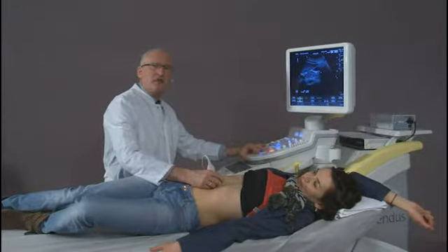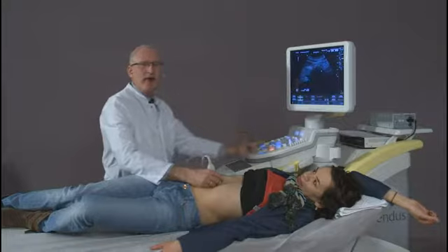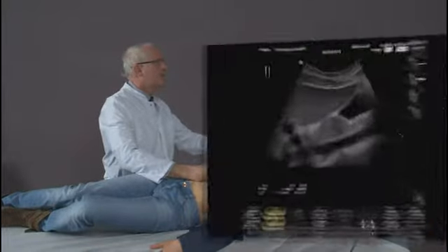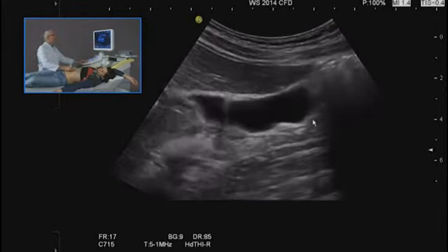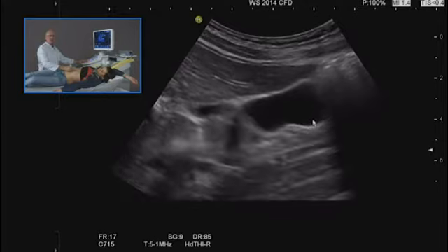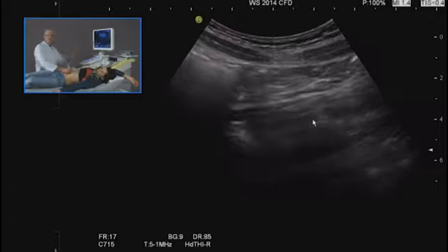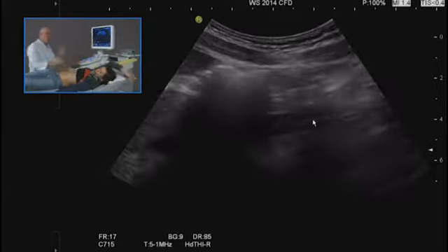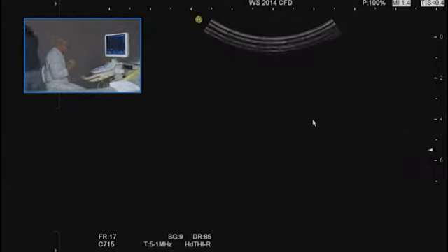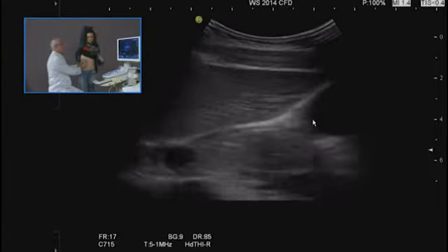The evaluation of the gallbladder should be done after a fasting period of, let's say, 6 to 8 hours. Take a breath. Even after this fasting period, sometimes, breathe normal, hidden stones and sludge cannot be delineated in one position. Therefore, we recommend, please stand up in the standing position. Elevate the arm above your head. Take a breath.